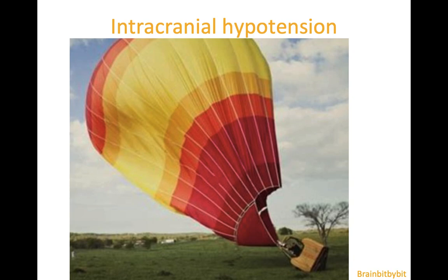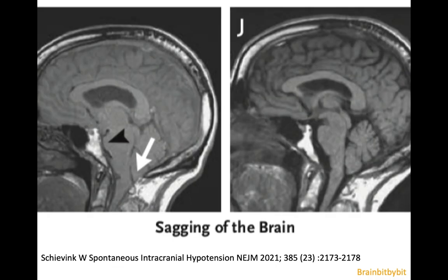I'm going to show MR signs of intracranial hypotension, because intracranial hypotension can give an image similar to a Chiari malformation, with so-called sagging of the brain. This means that the content of the posterior fossa is displaced inferiorly because of low intracranial pressure, leading to low-lying cerebellar tonsils, flattening of the pons, and abnormal morphology of the midbrain and pons. After treatment and restoring the intracranial pressure, this pattern normalizes.